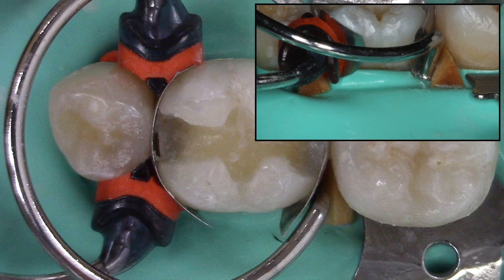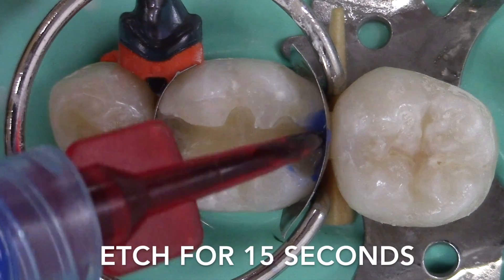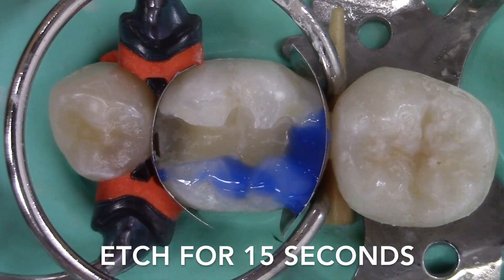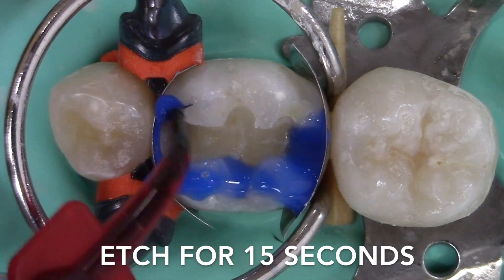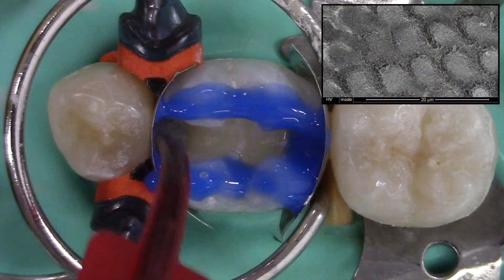37% phosphoric acid is applied to the enamel margins and the etchant is agitated with the etchant tip to spread any formed bubbles. Application of phosphoric acid creates a favorable etch pattern for micromechanical retention of the adhesive.